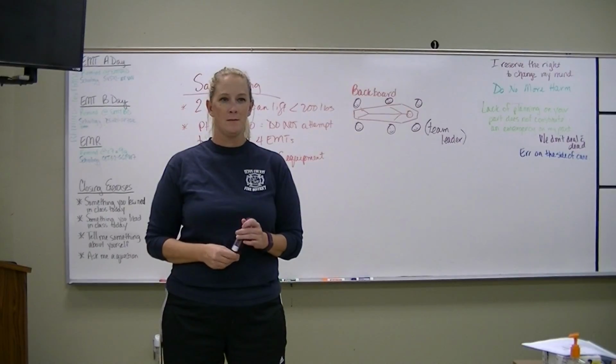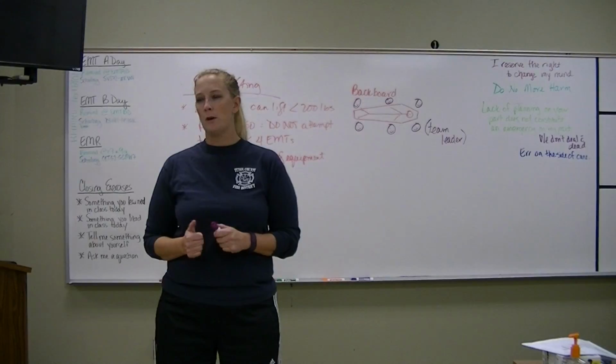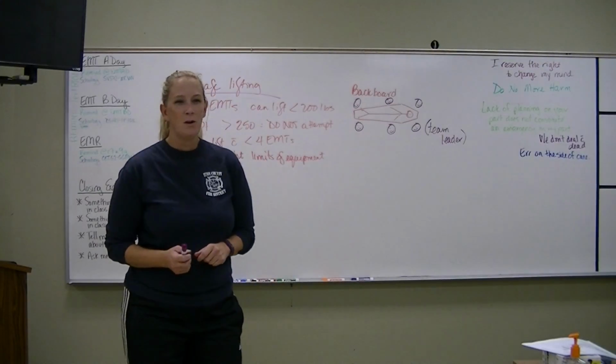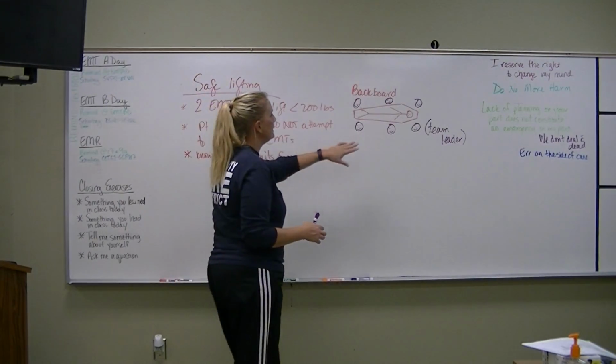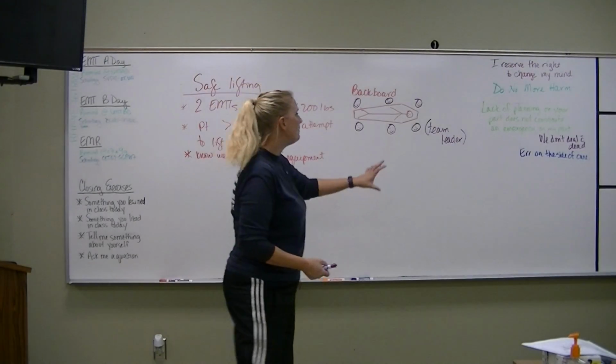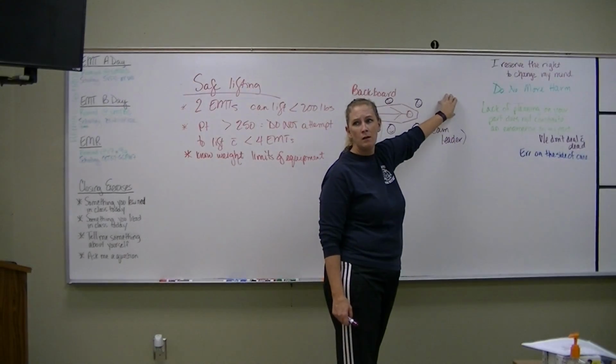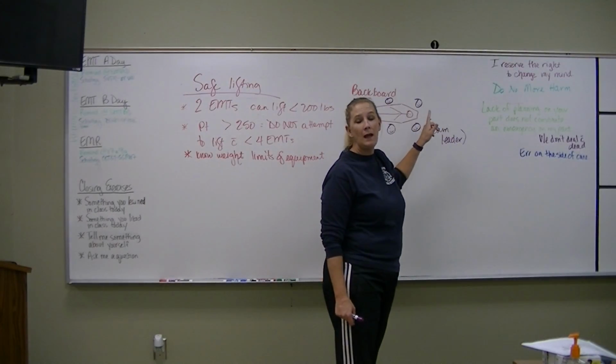Lower. Slower, faster. Watch your feet. Don't drop your patient. Whatever type of command needs to come to help move our patient on our backboard, that comes from our team leader. Our team leader is always going to be a person located where? At the head of the patient.